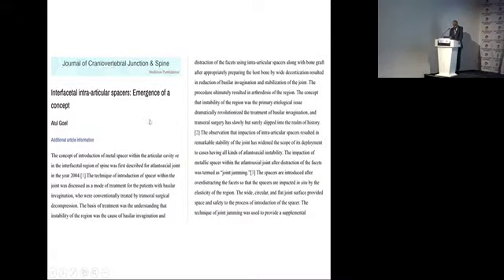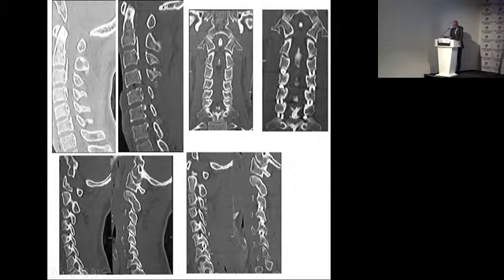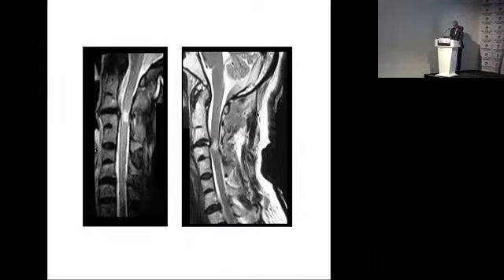So intra-articular spacers is an emergence of a new concept, which can be. I'm not saying it will be. There may be controversies, but it can certainly be a game changer. So you see here there are osteophytes, there are spinal cord changes, and you see immediate postoperative period, and these are, unfortunately, I'm not sure if they match each other. These are the spacers. This is another one.